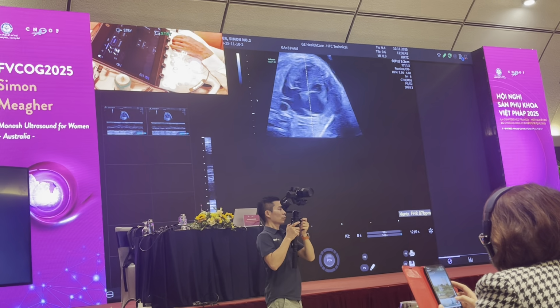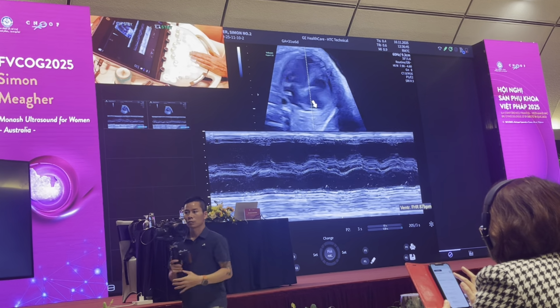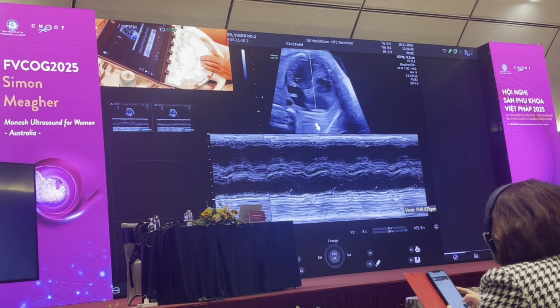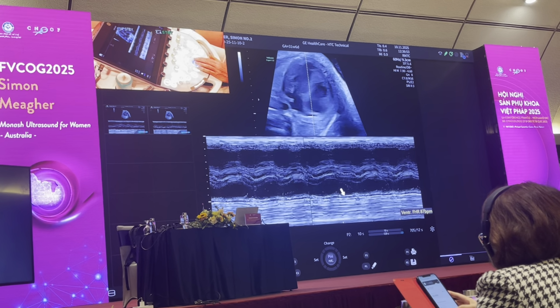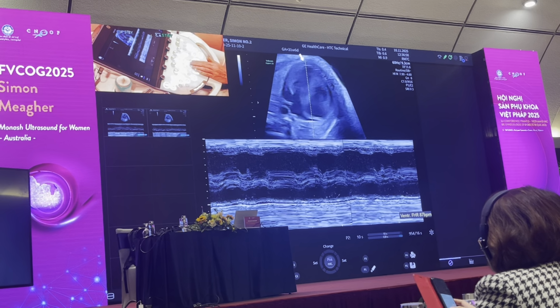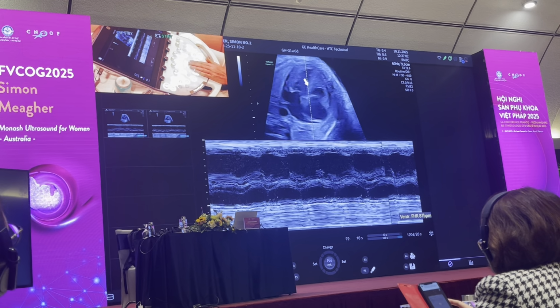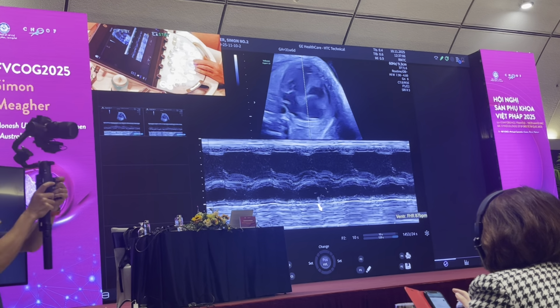I'll just magnify the image of the heart. When looking at the rhythm disturbance, you focus on the wall of the right atrium and you focus on the wall of the right ventricle. And when you come across this, you're comparing the ventricular motion. This here is the right atrial motion, not up here, down here, because it shows the ventricle first. So this is the left ventricular wall here. This is the interventricular septum here, and this is the right atrium down here.